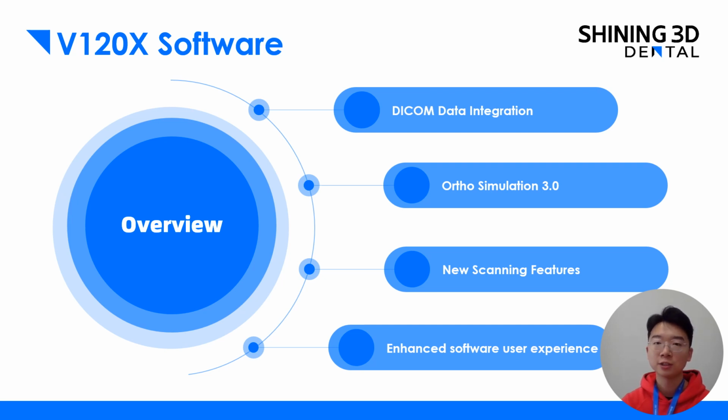DICOM data integration. Now we support import DICOM data to our new face scan software. And Ortho Simulation 3.0. It is a similar update with the intraoral scan software. So we have a new Ortho Simulation module and some new scanning features and the enhanced software user experience update as well. We will go through them one by one in detail in the following slides.